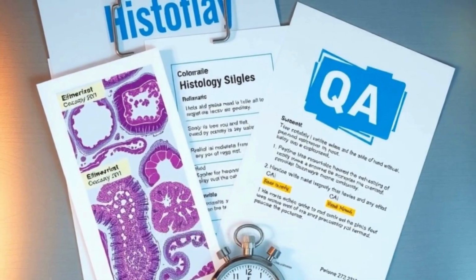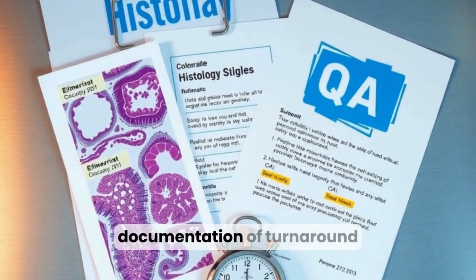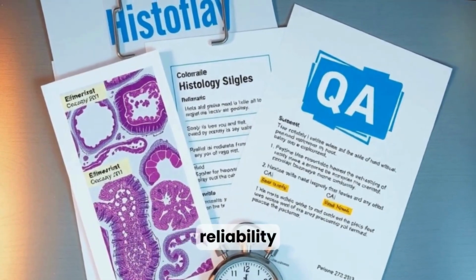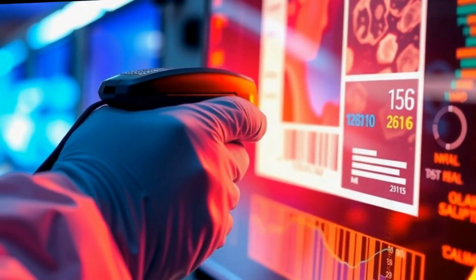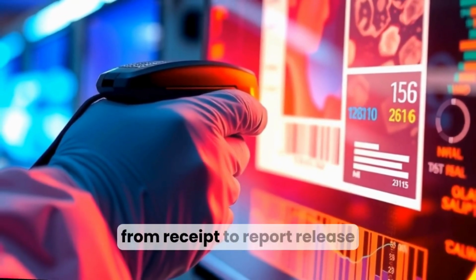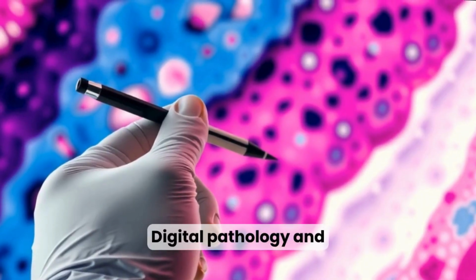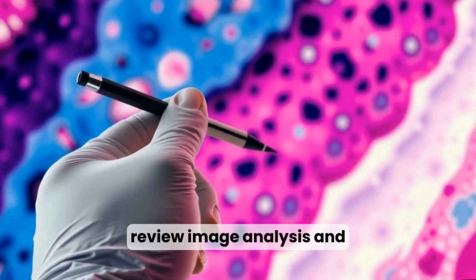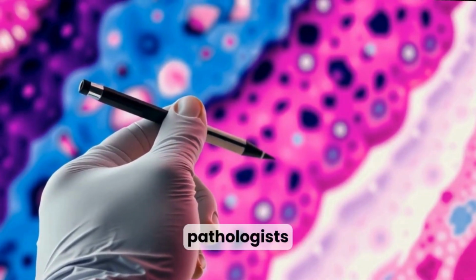Quality assurance measures include slide review, proficiency testing, and documentation of turnaround times to maintain accuracy and reliability. Laboratory information systems and barcode tracking streamline workflow, reduce errors, and trace specimens from receipt to report release. Digital pathology and telepathology enable remote review, image analysis, and archiving, expanding access and diagnostic tools for pathologists.